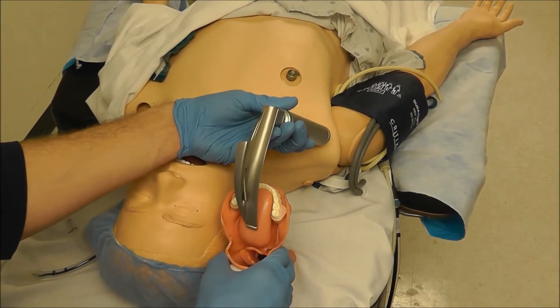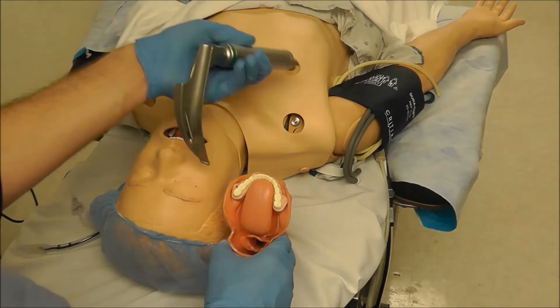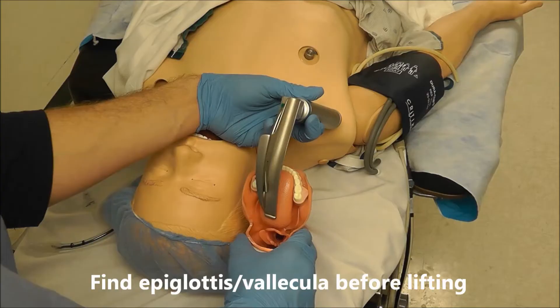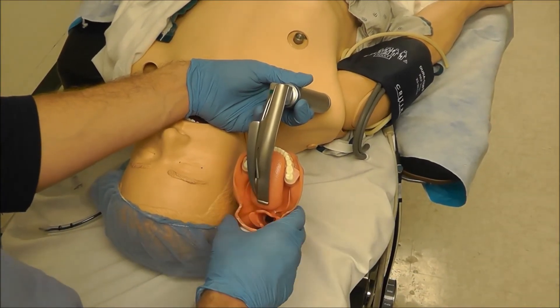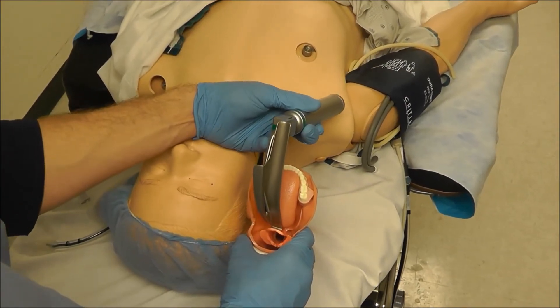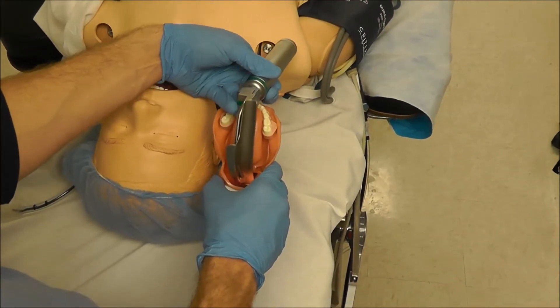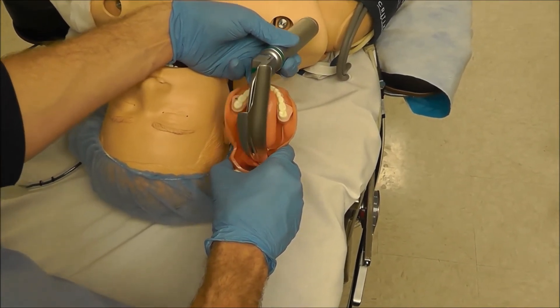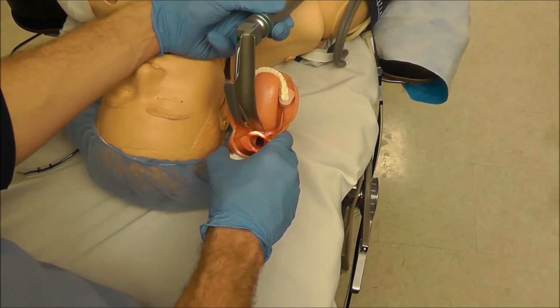You should not lift up unless you see the epiglottis first. You have to be in the vallecula before you lift. So if you're lifting and you don't see an epiglottis, you've got one of two problems: either you're not deep enough — in that case, just go a little bit deeper and then lift — or you might actually be too deep. If your blade is in kind of deep and you don't see an epiglottis, simply pull the blade back and then you should be in the vallecula and you can lift.